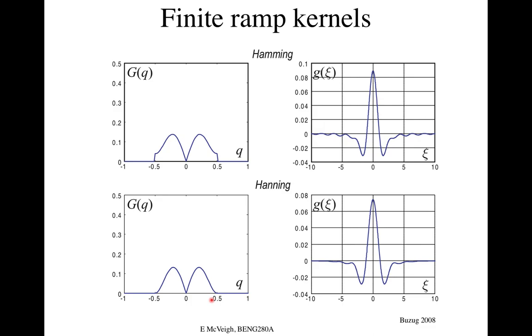That's true, absolutely. And depending on the clinical application, these filters are changed. That's all part of the protocol: how long you're going to acquire, what the mA is, what the kV is for this protocol, and then what the filters are for the reconstruction. And I'll bring in an example next lecture where three vendors' images of just hearts are shown. There's what was Toshiba and is now Canon, a GE, and a Siemens. We'll take a little poll as to which one you like, because they look totally different. They changed their filter settings.